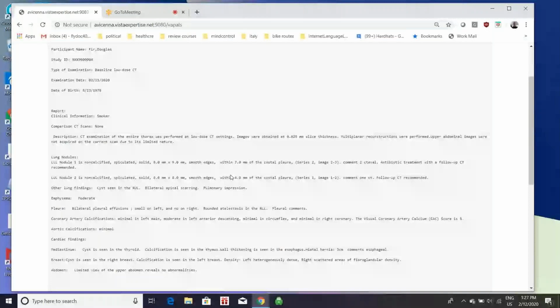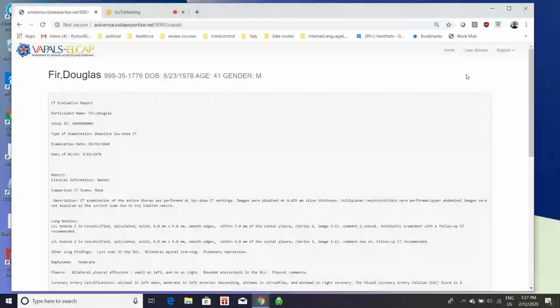Right, and it's become much more compact. Some of these things used to be like 4 lines, and now they're on 1 line or something like that. So right, it's in a more compact form. Have they tried the new format through the PowerScribe system in the VA? Well, they have, but they're still having some formatting issues. So we're still trying to figure out how to address those.